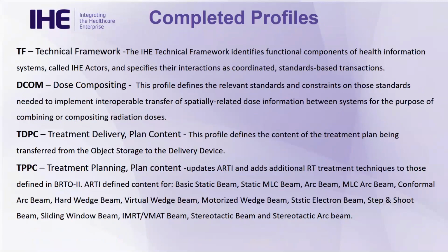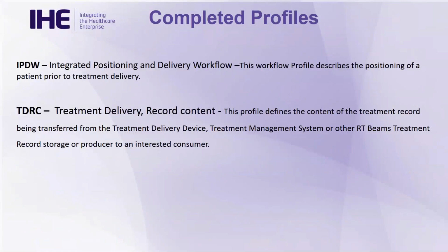One thing I wanted to mention briefly to show you how much work can go into some of these things. TPPC, it updates advanced radiotherapy objects and adds more RT treatment techniques. But just to show what ARTI contained, it had definitions for profiles for static beam, MLC beams, arc beams, MLC arc, conformal arc, hard wedge, virtual. You can see the whole list with a misspelling on static electron beam. But all those were specified. Well, they're still there, but now it's even more. And that's because we're trying to keep up with technology.